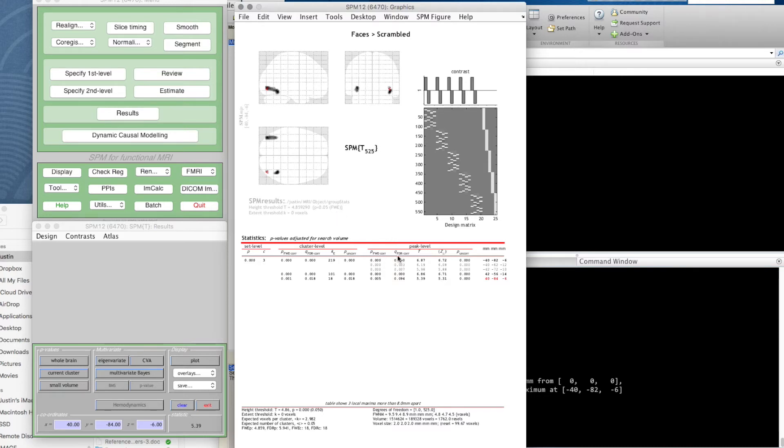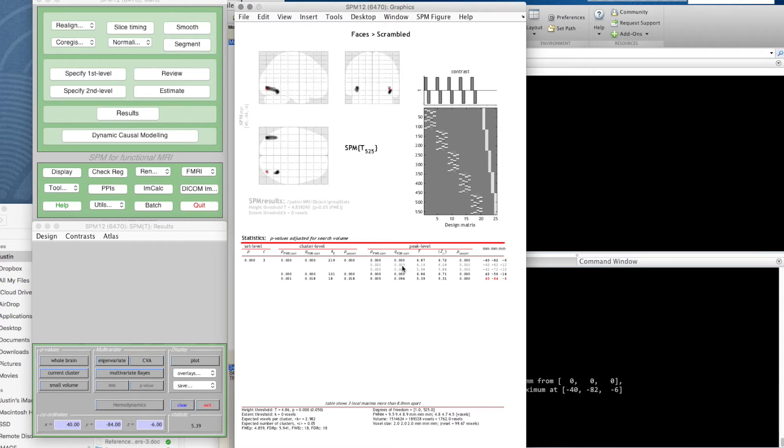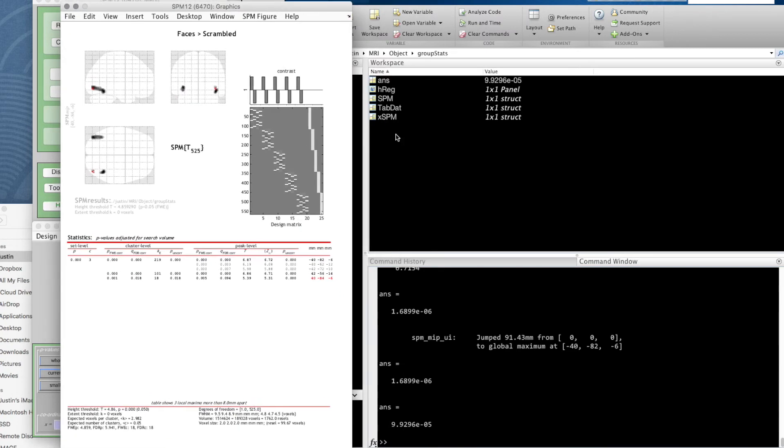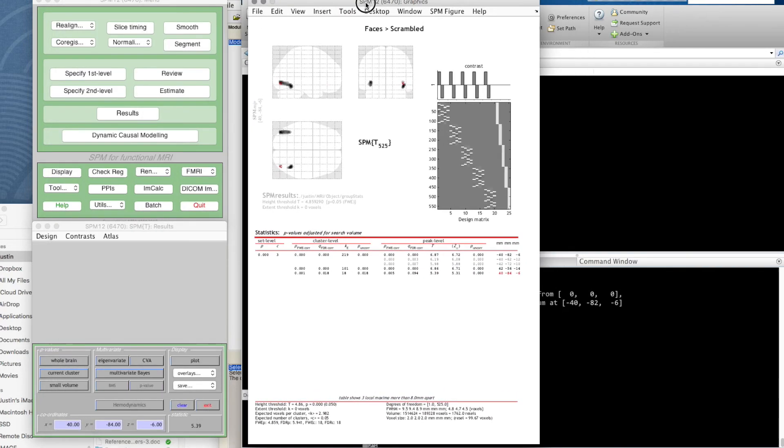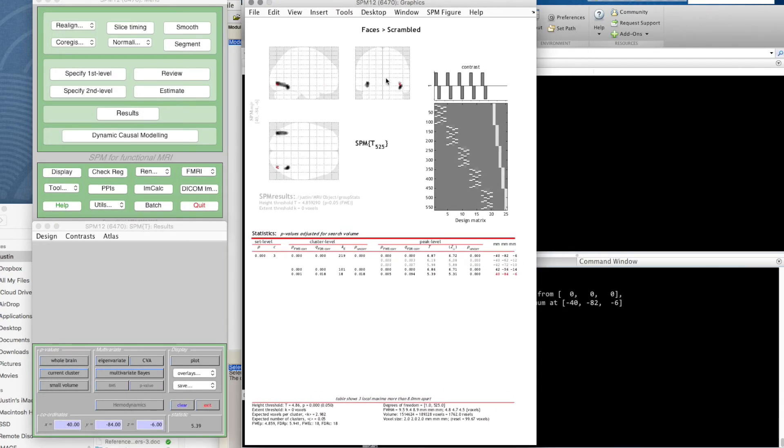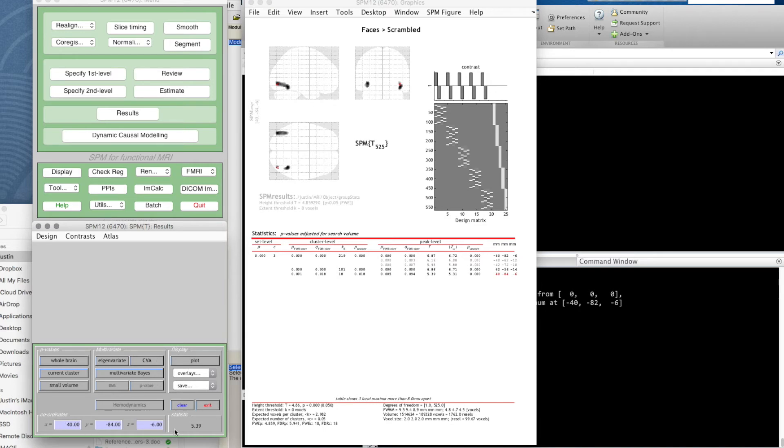This is the uncorrected p value, and then this is the corrected according to our family-wise error system. This is another way—this is FDR correction, false discovery rate correction. A lot of these seem to come out at zero because it only uses three digits after the decimal place. One trick you can do is if you right-click on something in the MATLAB window, it tells you what that number is. You can always get the data up.